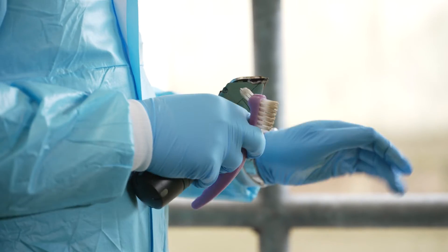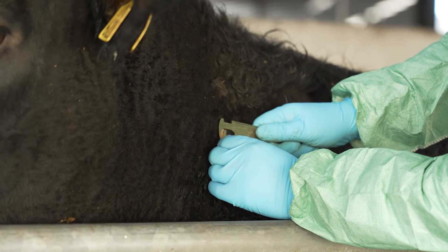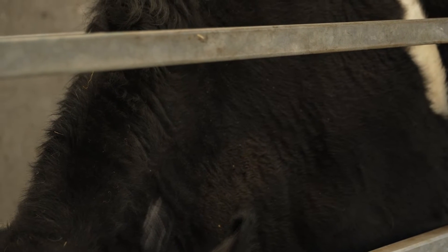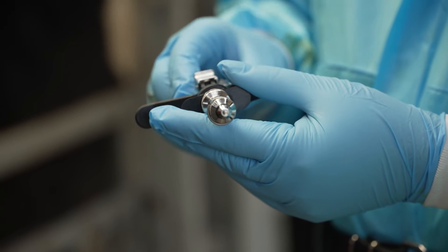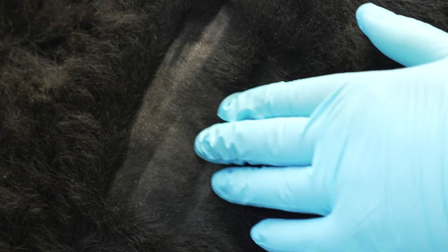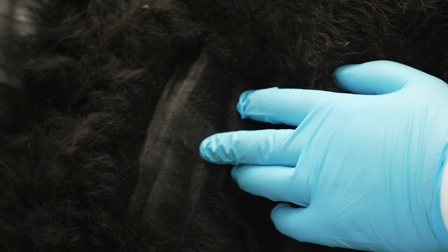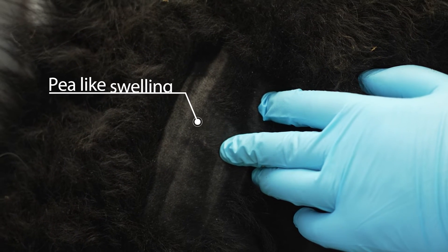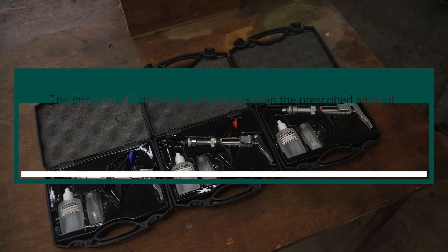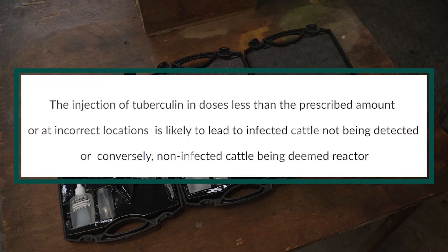The injection sites must be clipped. A fold of skin within each clipped area is taken between forefinger and thumb, measured with calipers, and the measurements recorded. The tuberculin must be injected by a method which ensures it is delivered intradermally; this is best achieved by inserting the needle obliquely into the deeper layers of the skin with the bevel edge outwards. A correct injection must be confirmed by palpating a small pea-like swelling at each site. Confirmation of this pea-like swelling at the clipped injection site is critical. Injecting less than the prescribed amount or at incorrect locations is likely to lead to infected cattle not being detected, or conversely, non-infected cattle being deemed reactors.